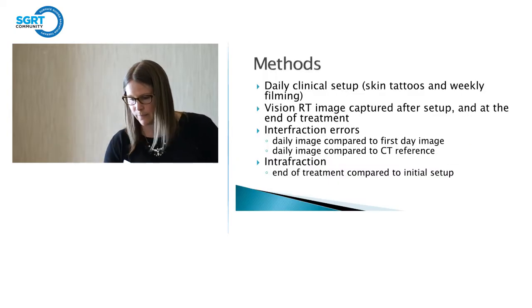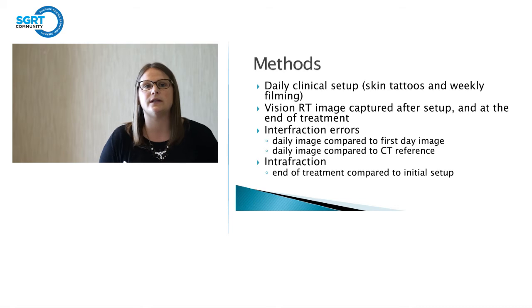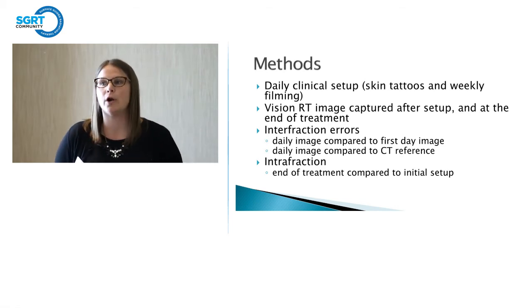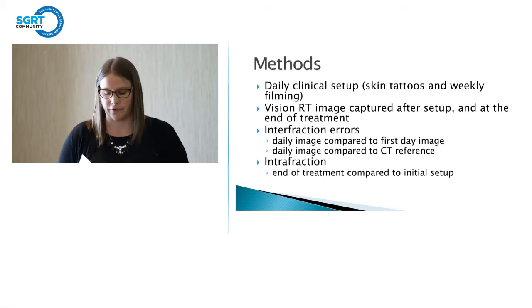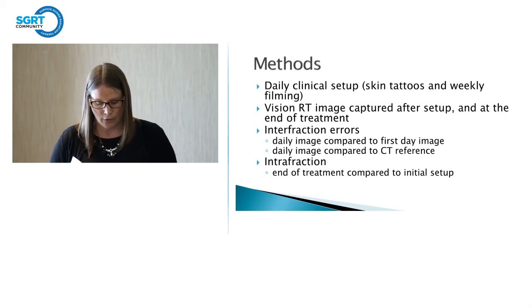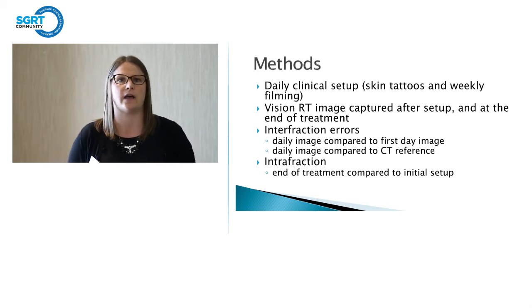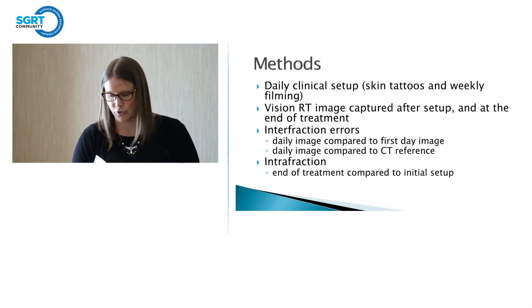So we did a study. We took data from 16 patients. We did pre-treatment and post-treatment surface images, over 236 treatments for these patients. So we used the offline surface registration to quantify the inter and intra-fraction motion for these patients. I'm sure everybody knows this, but intra-fraction is the motion that happens from the beginning of the setup through the end of that fraction. Interfraction is what goes on for the entire course of the patient's treatment, that sort of motion.